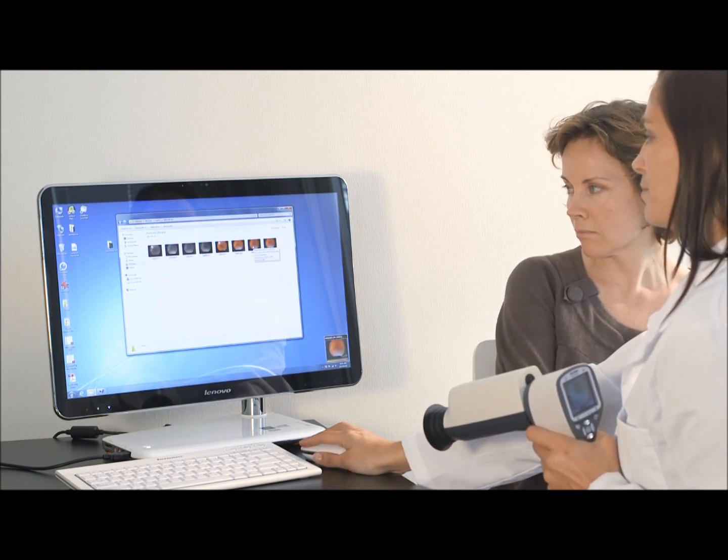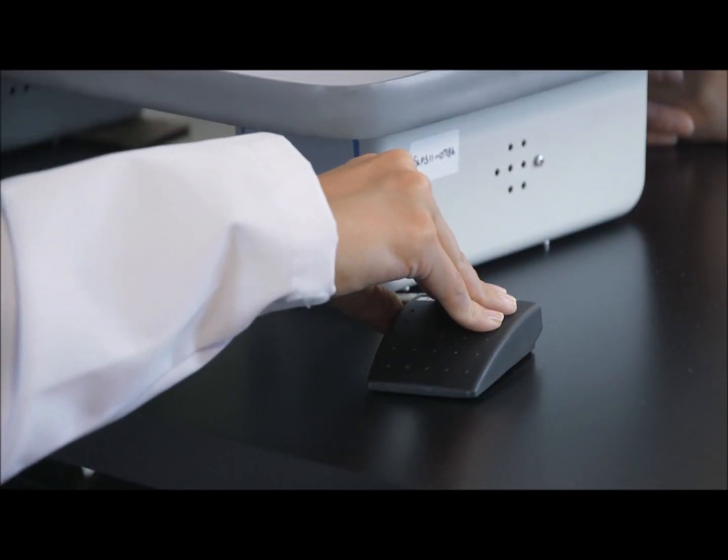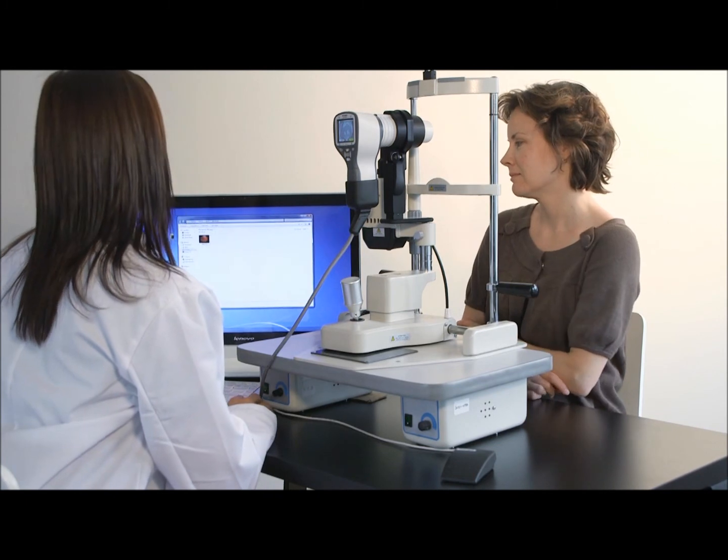If the camera is mounted on the slit lamp, the image can be transferred to the computer with the slit lamp cable. The taken image will then appear on the computer screen right after the image has been taken.